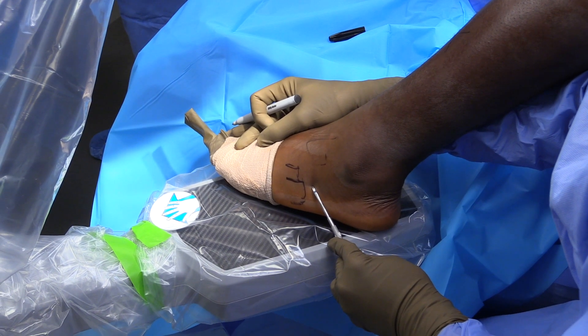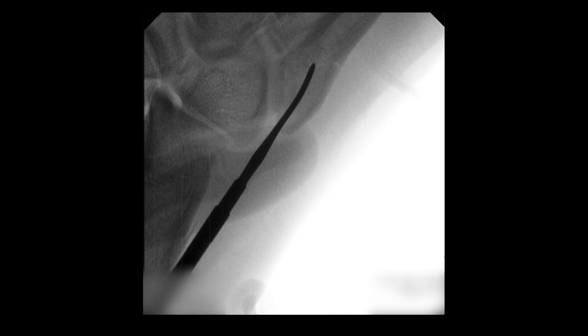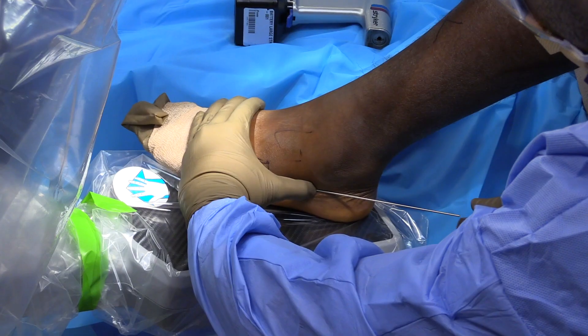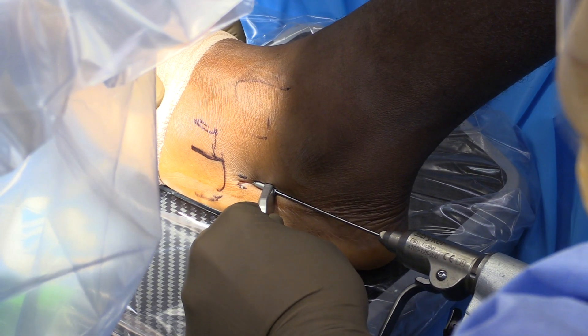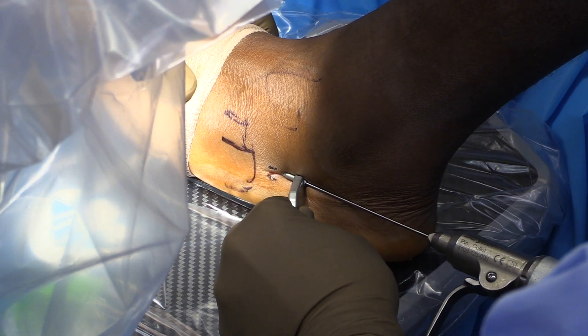The patient is placed supine with a C-arm adjacent to the operating room table. The base of the 5th metatarsal is palpated to determine the appropriate starting point. Image intensification to confirm where the incision should be placed is performed with a freer elevator. Prior to incision, a small percutaneous stab incision is placed to find the appropriate location, through which the guide wire is advanced. Both the AP and lateral views are used to confirm the correct high and inside position for guide wire insertion. After confirmation, we dissect down and use the soft tissue protector to protect both the peroneus brevis as well as the sural nerve.